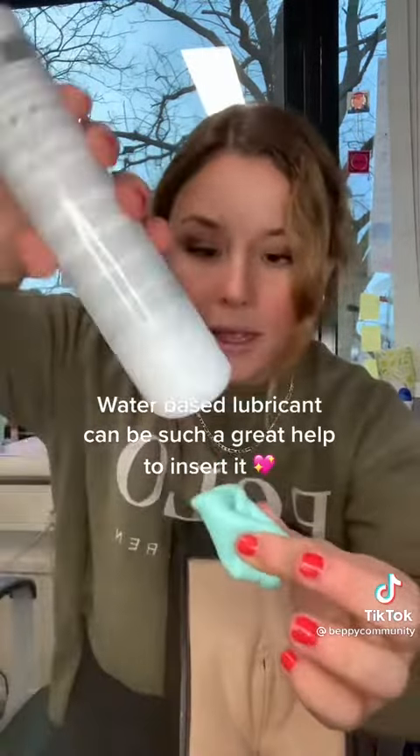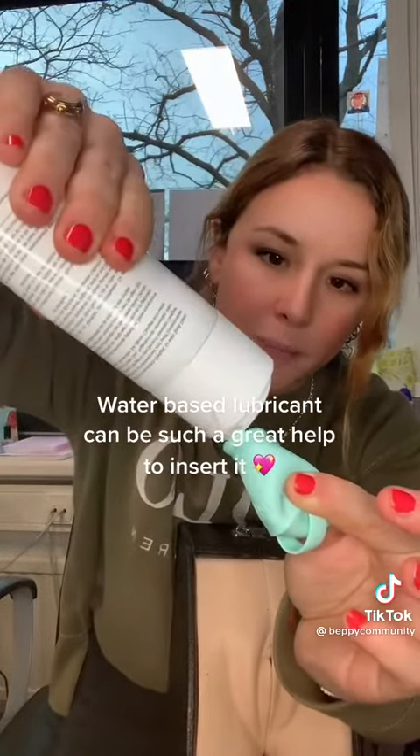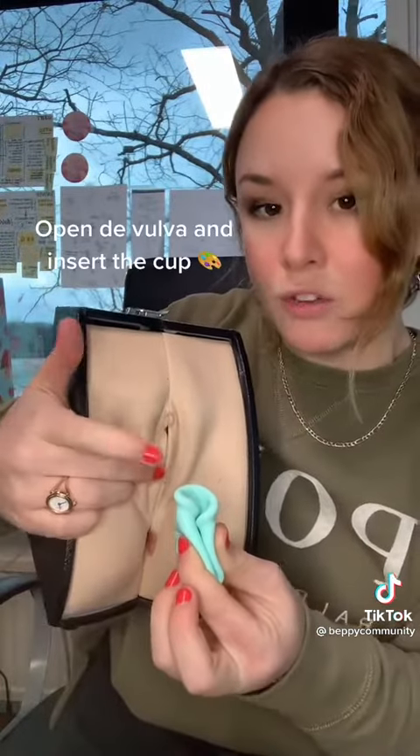Put a little drop of lubricant on the corner or rim of the cup, like this. A little bit of lubricant is going to make it easier to insert. If you use a little too much, you can just clean it — it's water-based, so it's no problem.